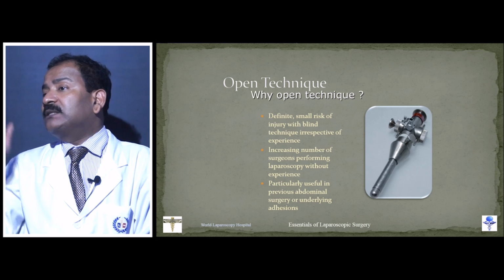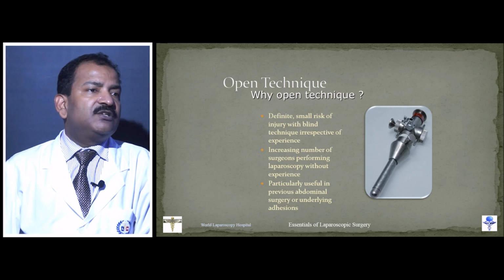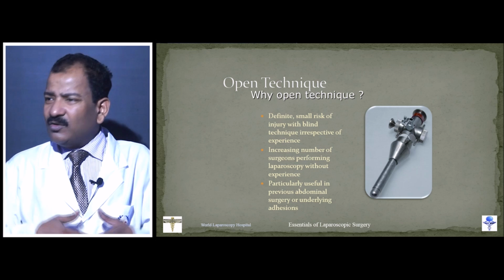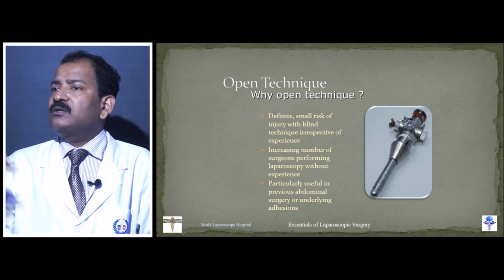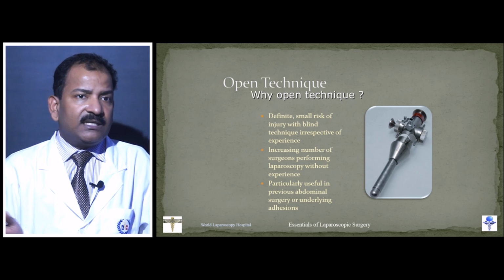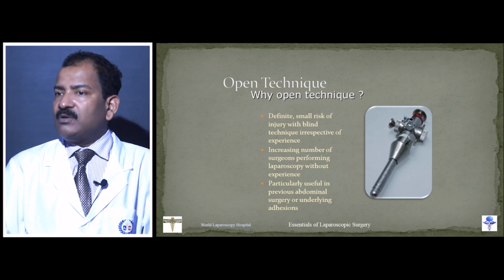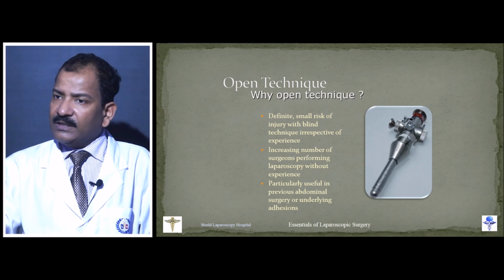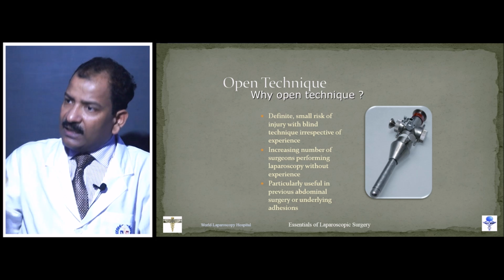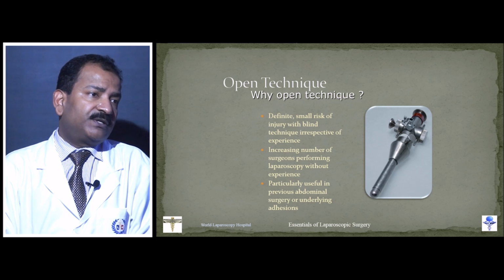Our patient had Koch's abdomen and was treated with antitubercular drugs; there was miliary tuberculosis with extensive adhesion all over the abdomen, and our trocar. Or the patient may have an aortic aneurysm which the patient does not know about. The ultrasonologist has just given you the report about the ovary, he has not mentioned the aortic aneurysm, and our trocar can directly puncture that aneurysm. The patient may die on the table due to aortic rupture.